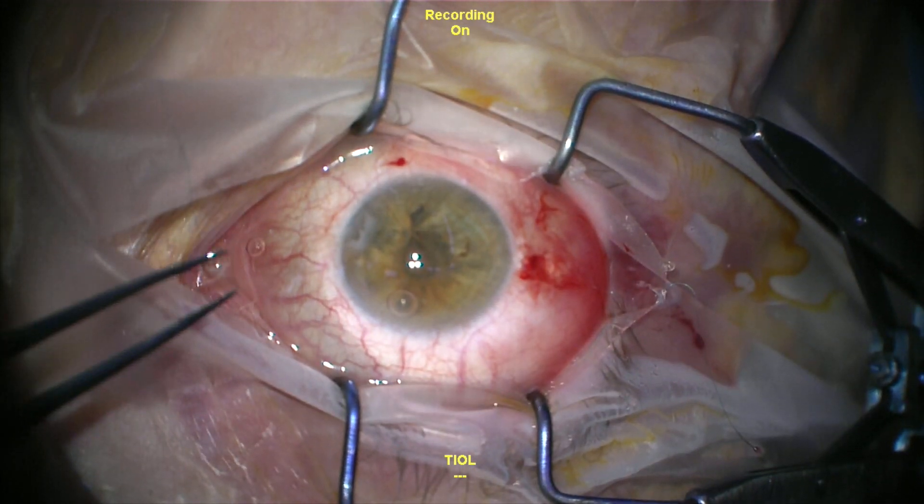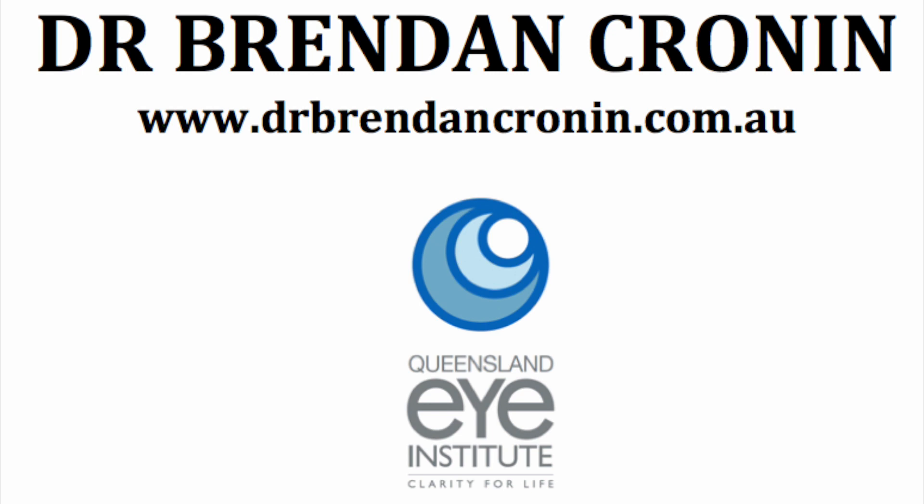These are well-constructed wounds so they don't leak and don't require a suture. I use intracameral antibiotics. The patient had an excellent cosmetic result and a big improvement in their visual symptoms.